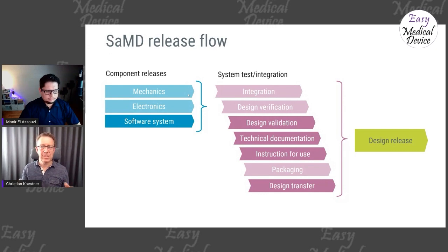So the software as such needs to be accompanied with additional information to become a design release. And this makes continuous deployment perhaps a little bit of a challenge, because you as a legal manufacturer need to have the big picture, and that's not only the software, it needs to fit together with the other pieces.